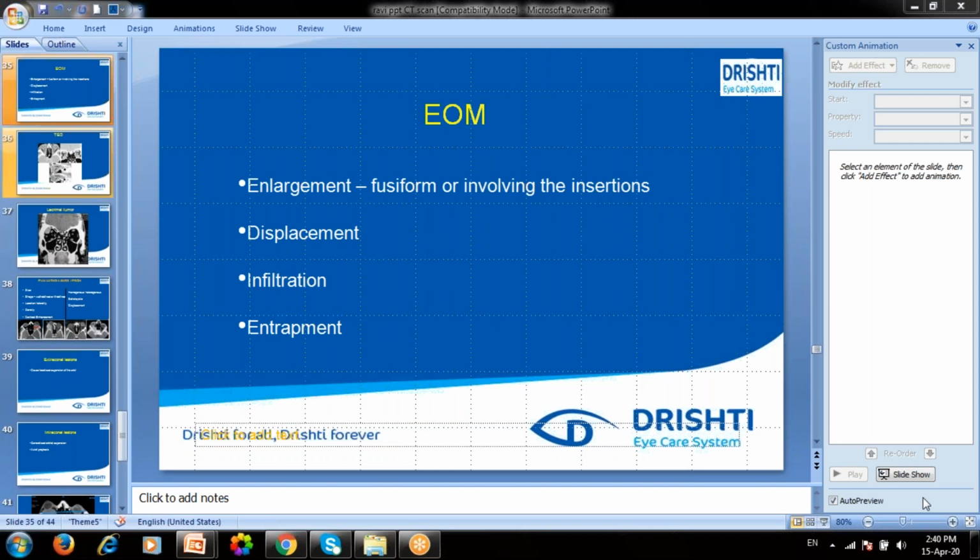So if you are in a not so developed area and there is a simple CT scan, you can do the diagnosis from that also. But if you want advancement in your result, if you want the total location measured, the total size and till where the extension is, and always the clarity in the image, these things come with the advancement in the CT scan. In all the advanced CT scans, these things will be different from your old CT scans.